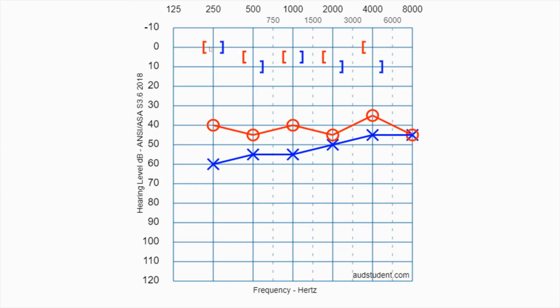Our third question, general shape, obviously corresponds to the configuration, flat. And our fourth question, is there a degree that matches with the threshold? That one, as you might have guessed, corresponds with the degree, which we found out to be moderate.